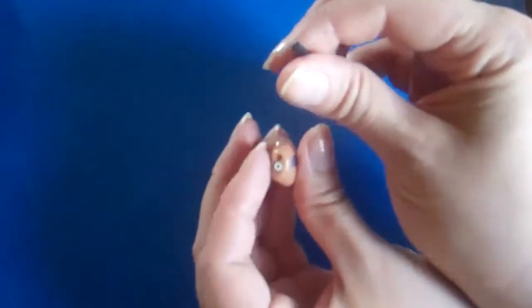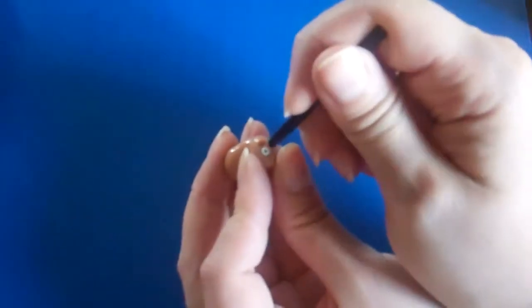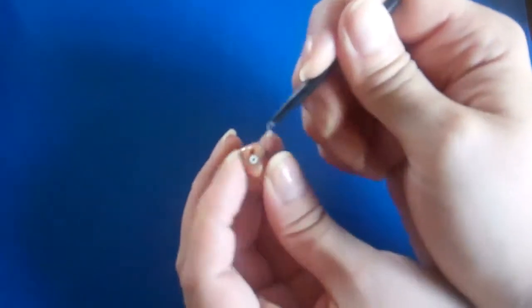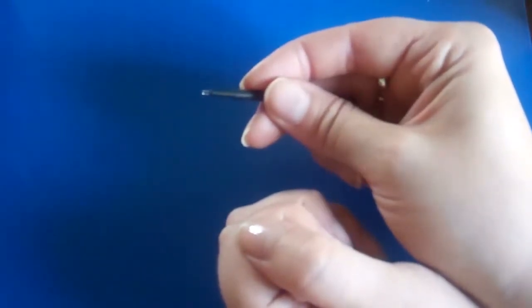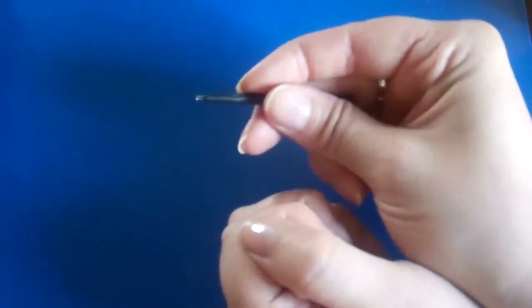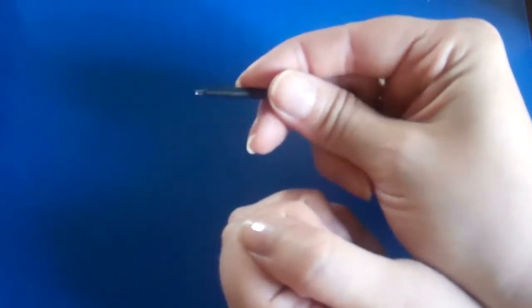The wire loop, depending on the hearing aid that you have, can be used to take away any debris that you may see at the base of the hearing aid. But you want to be careful, and you want to ask your hearing instrument specialist or audiologist if this is a tool that you will use on your specific hearing aid, because it can also do a little bit of damage if used incorrectly.